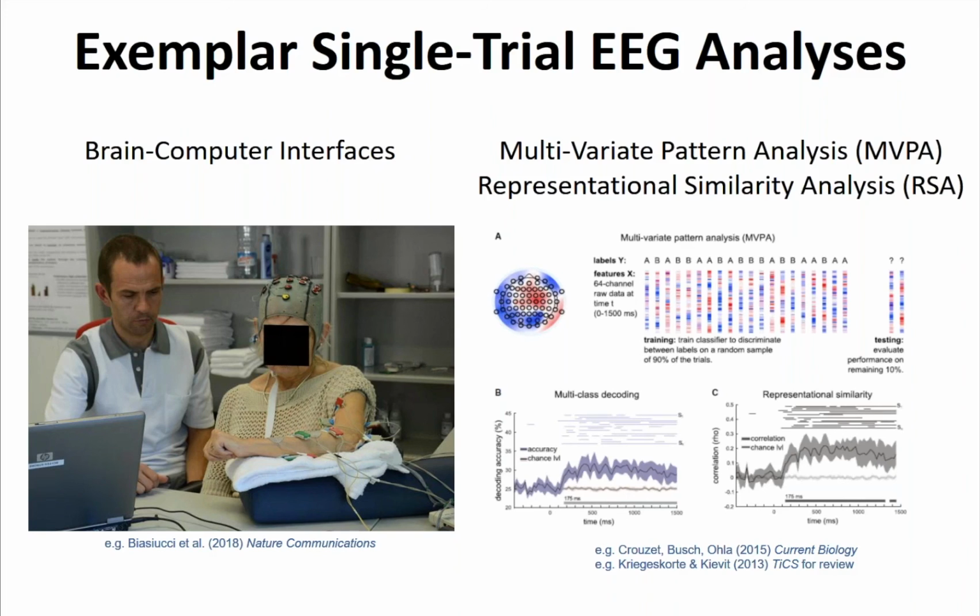So what you should take home from this is that indeed, looking at trial averaged event-related potentials is of course one way of looking at your data. But by looking at topographic information, in fact, the signal to noise is quite increased. In time, it's very different. Typically, we'll look at one electrode and a time series, and it's hard to see the signal in that with the naked eye. But looking at single trial topographic information, one can often see the signal quite well at the single trial and single moment in time level.